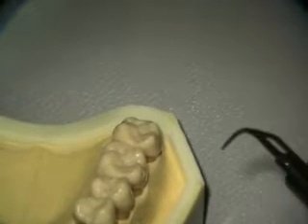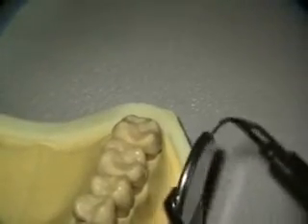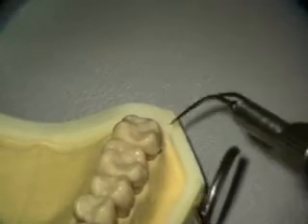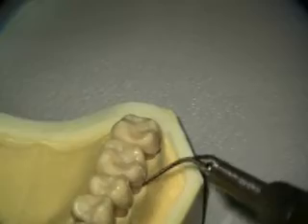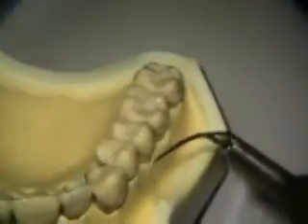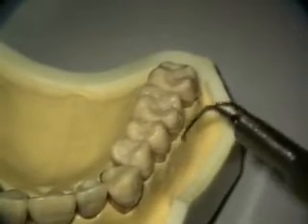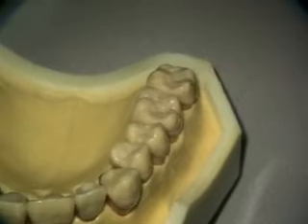I have my patient positioned and I need to do the tactile debridement. I've got my mirror in one hand, which I typically just leave there, pushing the soft tissue out, cleaning, doing my tactile debridement first so that I can remove plaque and some calculus and dilate the soft tissue and the pocketing.